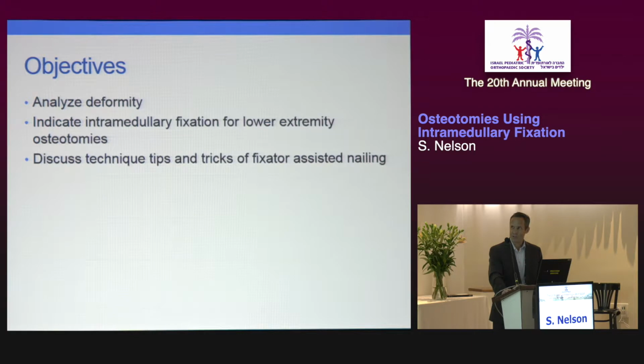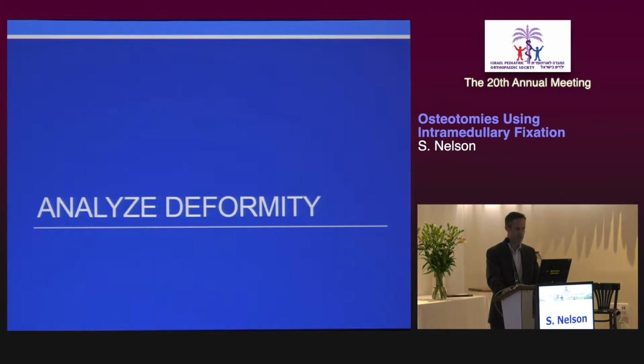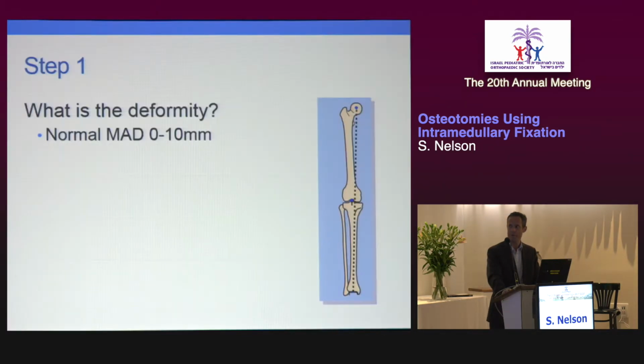We're going to talk about a few deformities, analyze them, and indicate intramedullary fixation, which, using the fixator-assisted nailing techniques, combines the accuracy of external fixation, providing rigid fixation that allows early rehab and weight bearing for our patients and avoids many of the discomforts and inconveniences of external fixation in the recovery period.